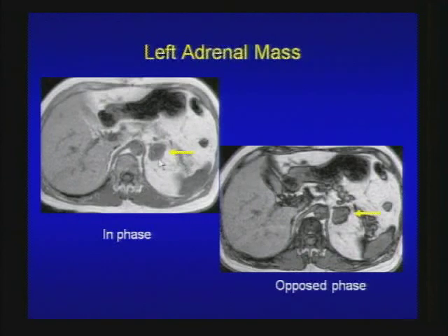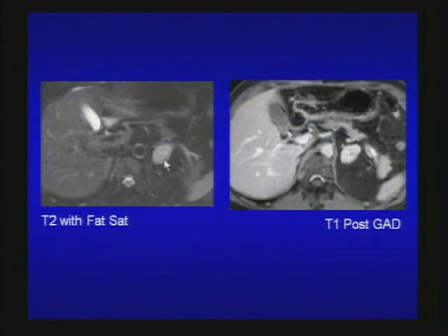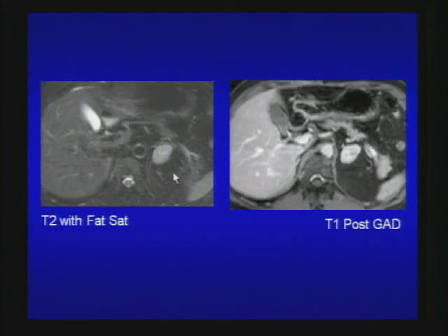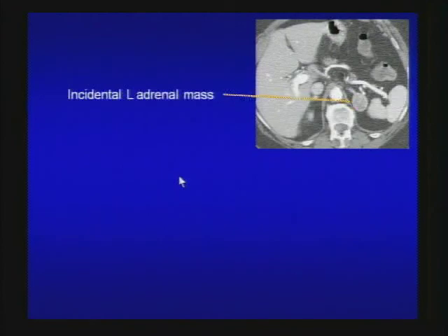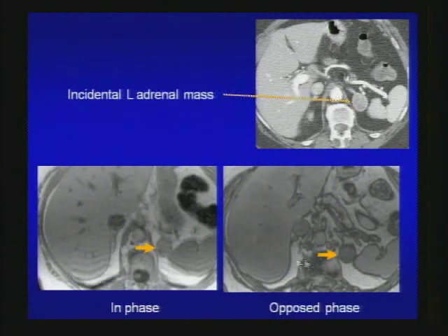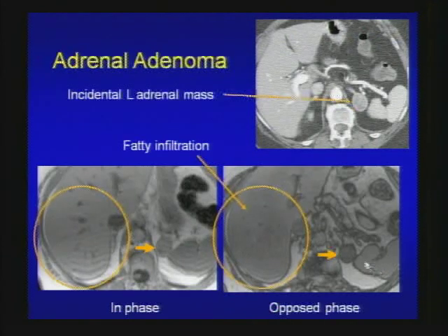Another case: incidental left adrenal mass. Does not have signal dropout on opposed-phase image compared to skeletal muscle or spleen — not typical for adrenal adenoma. On additional images it's fairly bright on T2 with fat saturation and shows homogeneous enhancement post-gadolinium. Differential: adrenal metastasis or pheochromocytoma. This turns out to be renal cell carcinoma metastasis, and on CT four months after chemotherapy the adrenal gland returns to its normal shape. Another incidental left adrenal mass demonstrates signal loss on opposed-phase imaging compared to the adjacent spleen — consistent with benign adrenal adenoma. Note the fat infiltration of the liver on opposed-phase imaging, emphasizing that the liver should not be used as a reference.